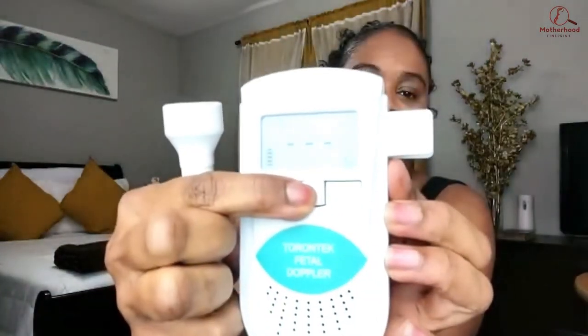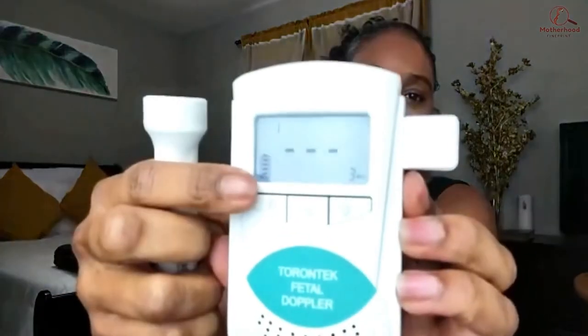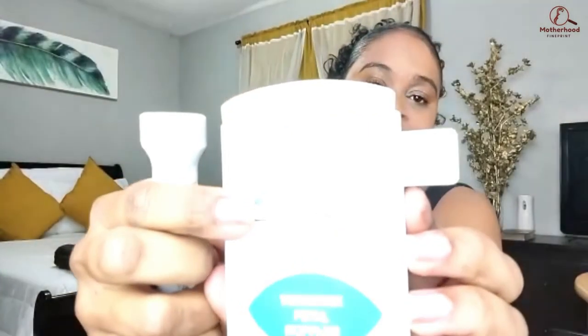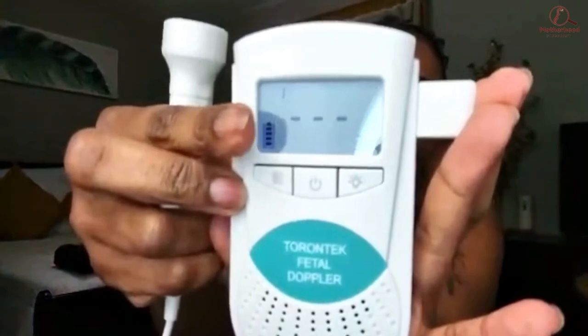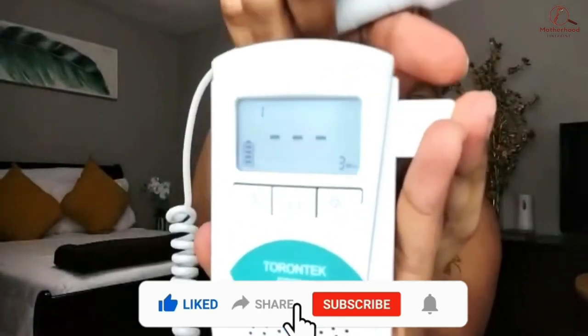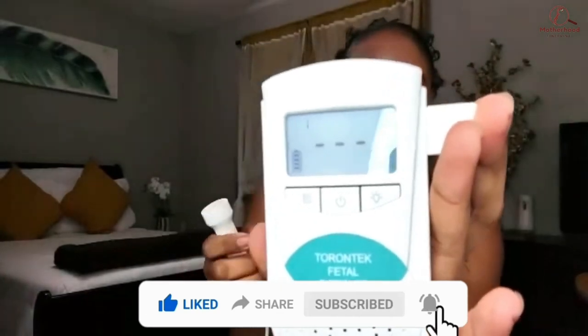We're going to plug the probe in so you guys can hear what it sounds like. Once I plug the probe in I'll go ahead and turn it on. Right away you can see the battery level indicator in the corner, so you'll always know if the batteries are low. You have those three lines where your baby's heartbeat will show up, and there will be a little heart in the corner once you start monitoring. I'm not on a pregnant belly so you won't hear an actual fetal heartbeat, but I'll rub the probe on my arm so you can hear how loud it gets.